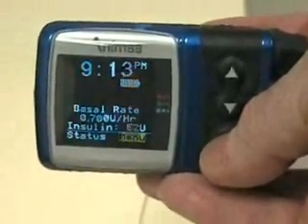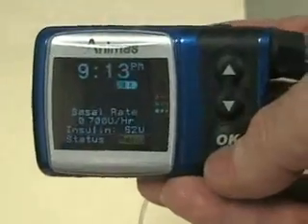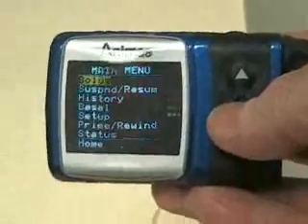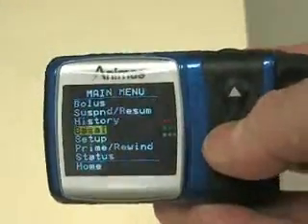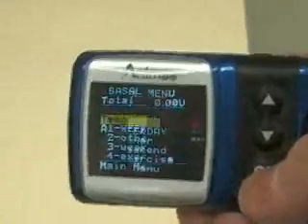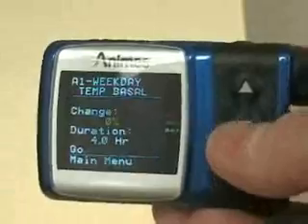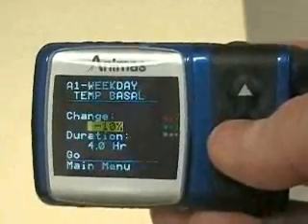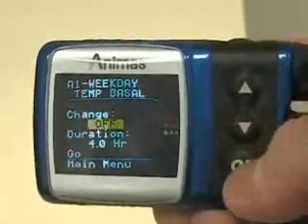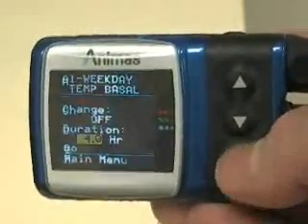To demo how to give a super bolus using the Animas 2020 pump: from the main screen I hit OK, then scroll down to change my basal rate setting. I click OK and click OK again to choose a temporary rate. In this case I want to set it off completely, so I hold the down arrow until I get to the off position and click OK.